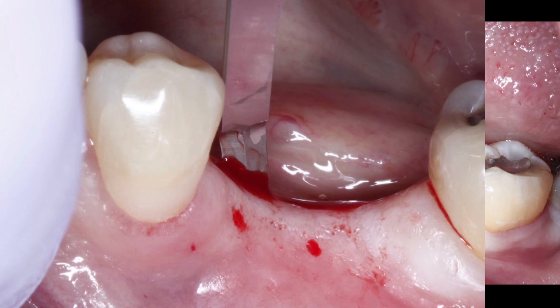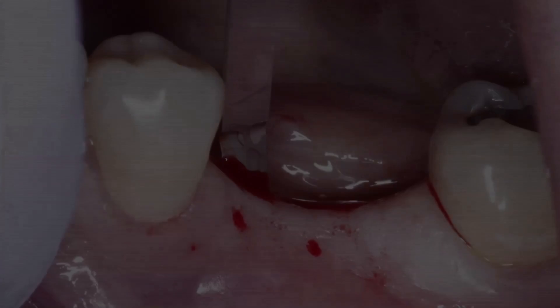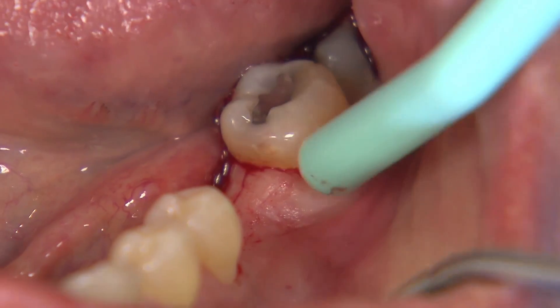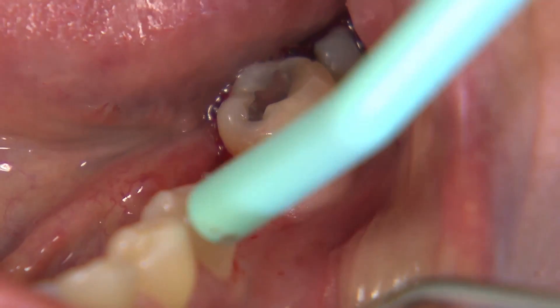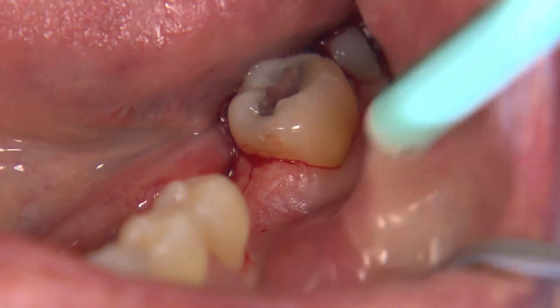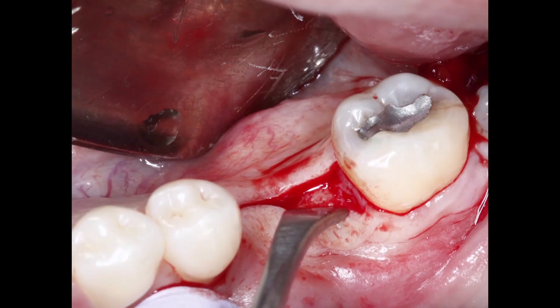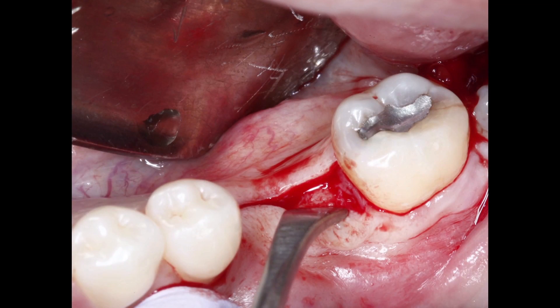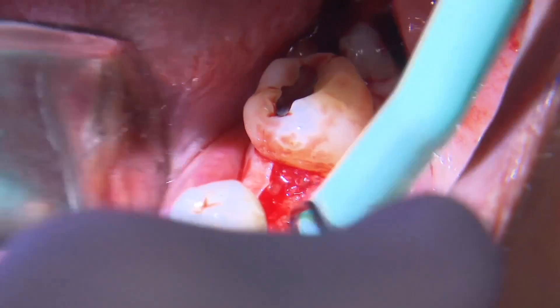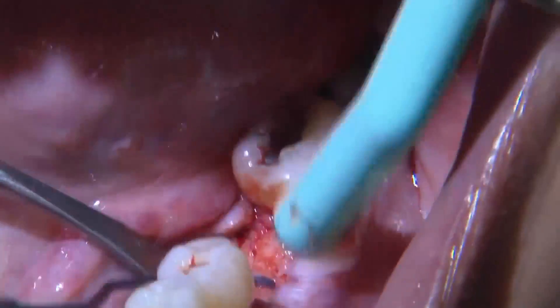In this scenario, I do a full thickness flap reflection and I want to make sure that I have access to the cortical plate of the bone. Once I reflect the flap, I'll go through and remove any residual soft tissue. I want to make sure that I have full access to the bone, as you can see here.